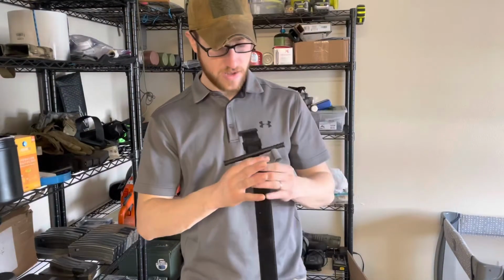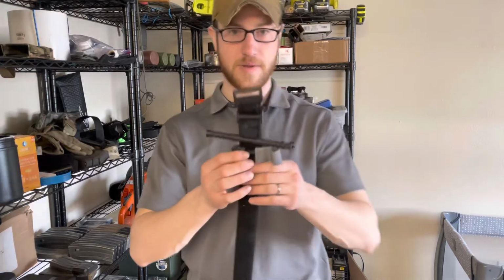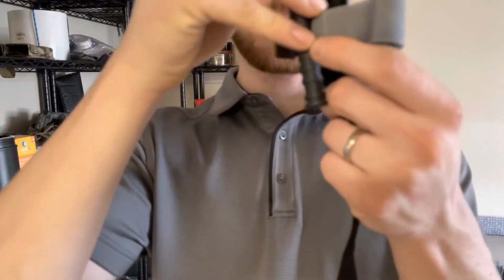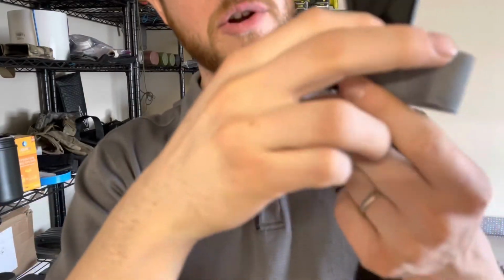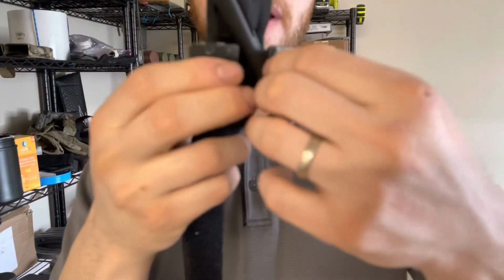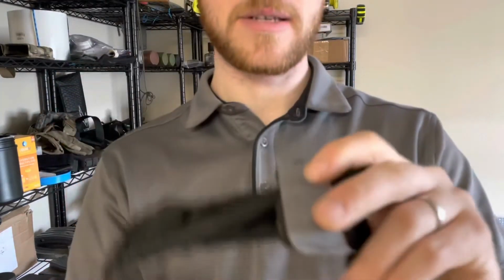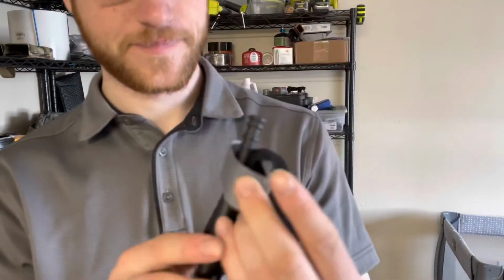So you then have your, probably should show you that too. You have your windlass securing clip. This works by giving you something to secure the windlass in. And then you have the windlass clip securing tab right here that also has a little place for you to write the time of application of the tourniquet.